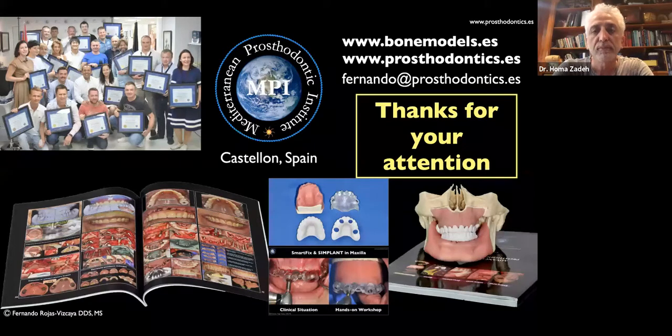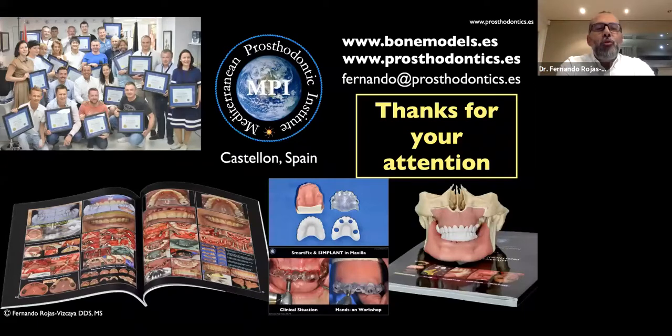So my experience with this type of prosthesis in full monolithic zirconia is limited to less than 15 cases. If it's only white aesthetic, in the area of the interproximal papilla, the connector is thin. I don't have any fracture at this point, but we need to make the prosthesis a little bit bigger in the buccal-palatal direction.